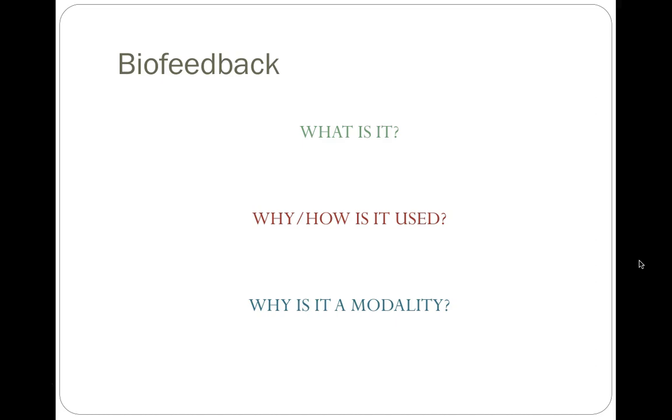Just like when we did the e-stim for our neuromuscular reeducation, you do your 10 to 15 reps with the machine, but you're making sure that they are trying to contract without the machine so that they can make those pathways. Same thing with feedback. We're going to do a couple sessions with feedback, but then we're going to take the feedback off and see if they can recreate, because that's what's going to regenerate some of those neural pathways.